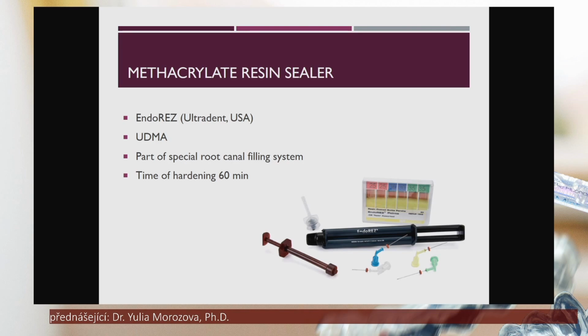And methacrylate resin sealer, this is the next resin-based sealer. In this case, UDMA resin is used, and is used in some special commercially available materials. One of them is the system EndoREZ from Ultradent company. It contains the different canal special sealers, gutta percha, for the application for the root canal filling obturation. Time of hardening is relatively large, up to 1 hour.